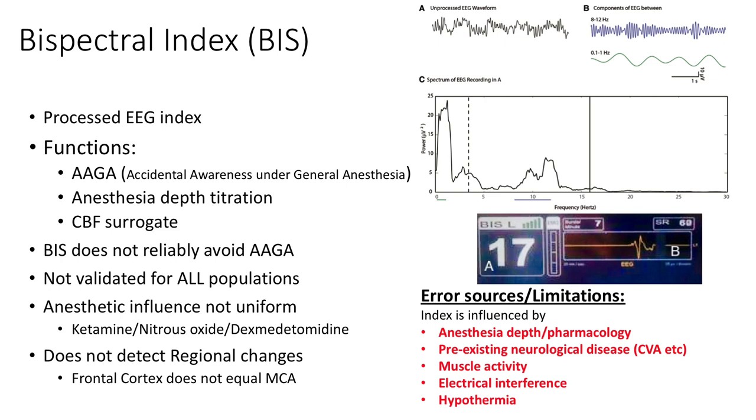Now, an intraoperative monitor where we're using this kind of technology quite frequently is the BIS monitor, or the Bispectral Index. We're using the same form of methodology, however it is applied with minimal technology and maximizing the information. So we are taking a very short fraction of EEG, a very localized region, but that brain pattern I interpret as a reflection of brain activity. So the BIS is a very, very processed EEG.